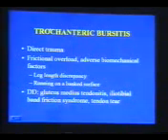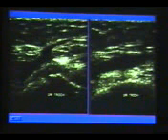Trochanteric bursitis can be due to direct trauma, frictional overload, adverse biomechanical factors. Leg length will be different from the contralateral side, running on a banked surface, and for differential diagnosis you will look for gluteus medius tendonitis, iliotibial band friction syndrome, and tendon tears. There are few cases in which you can see the tendon discontinuity.